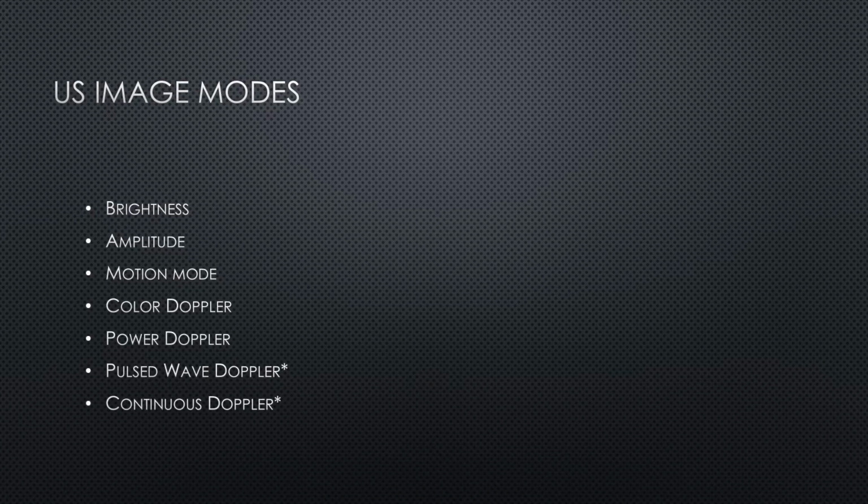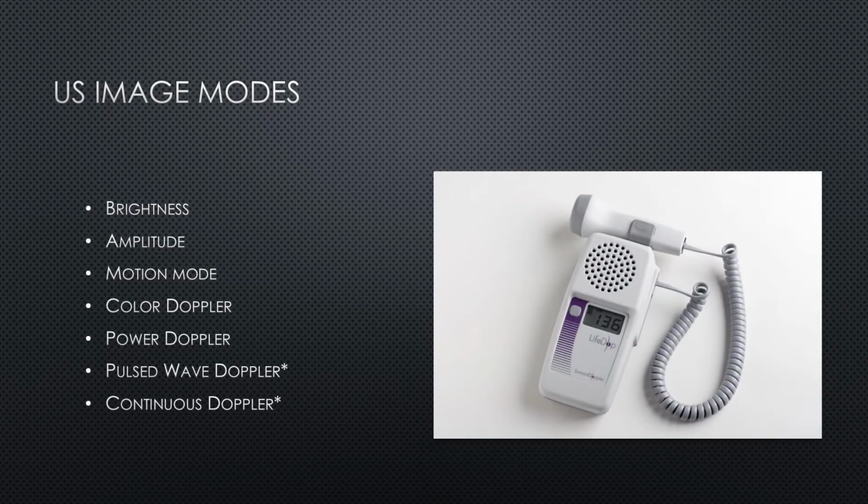So it's actually more commonly used in handheld Doppler machines, such as this one right here. So your vascular OB probes, those are dedicated continuous Doppler machines that convert the sound to louder non-ultrasound sound, whereas if you're doing it on an ultrasound machine, it's converting it to a visual representation. And the energy transmission of continuous Doppler is similar to M mode, so it is safe for use in pregnancy.